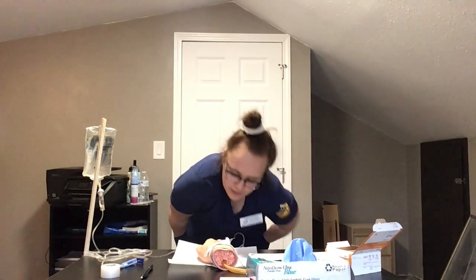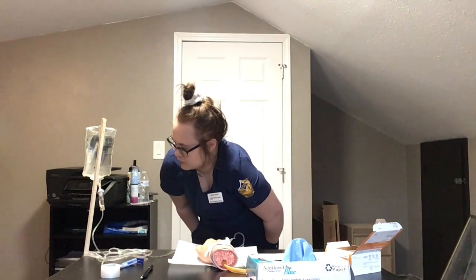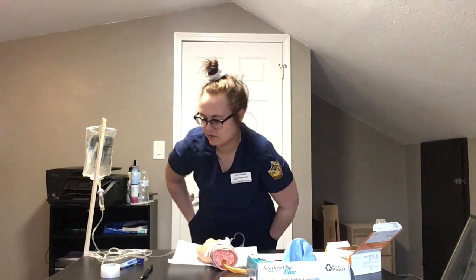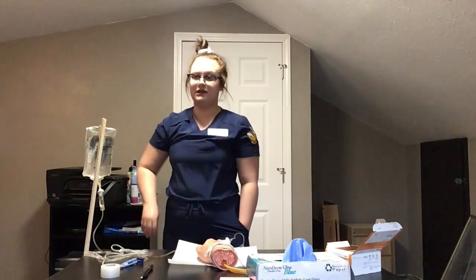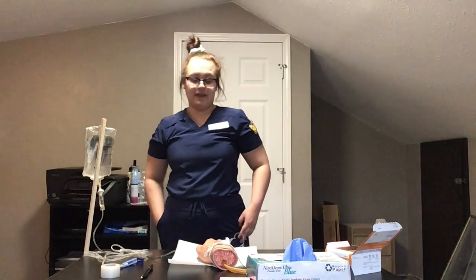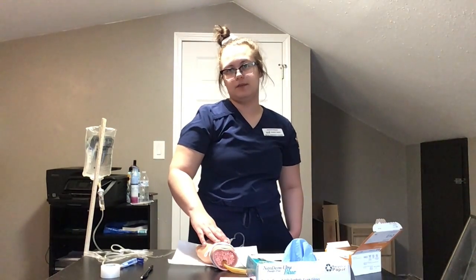Then I would inspect the IV, and I would inspect the patency of the IV, and I would inspect the tubing of the IV. If this is a real situation, I would want to make sure this wasn't all crinkled up like this. Nothing is kinked, and that the IV itself is still inside this vein, that it hasn't become dislodged or anything like that.